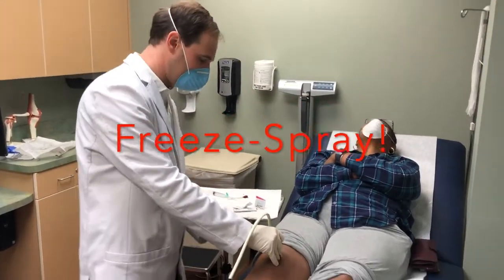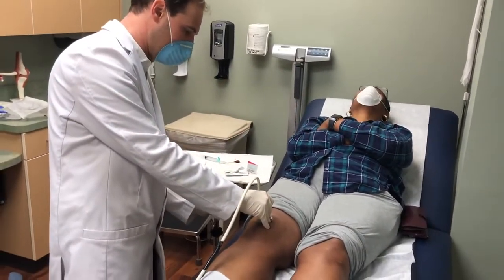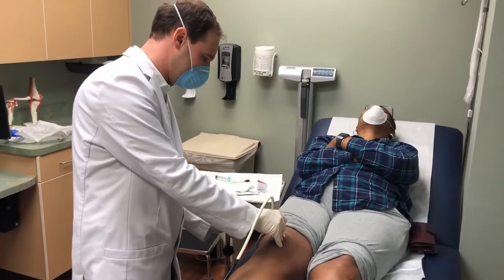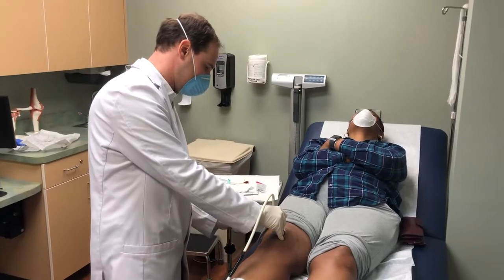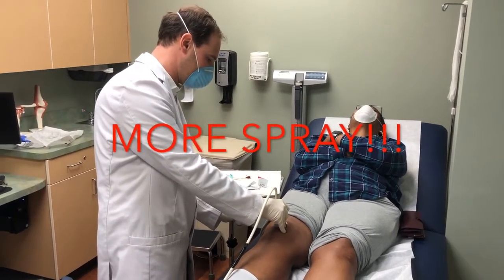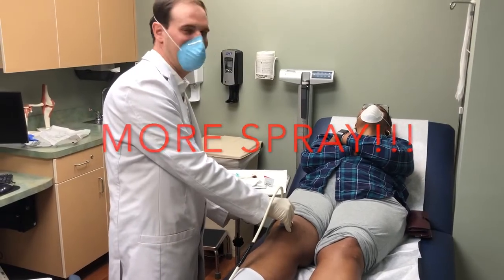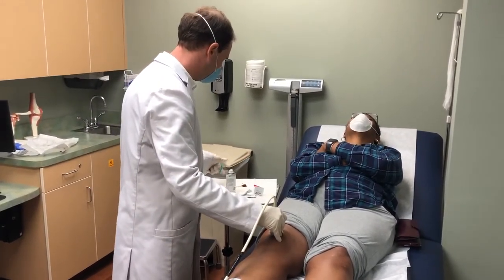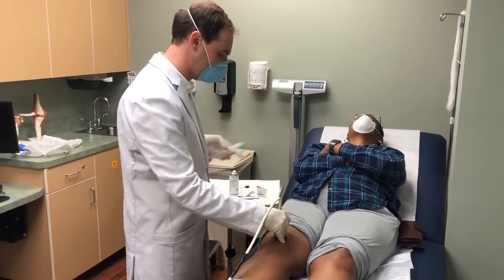Once we've identified the spot on the ultrasound, we numb the area with a cold spray. This cold spray numbs the skin. We apply a generous amount of spray — the more the better. Once that skin is numb, we're ready to administer the injection.